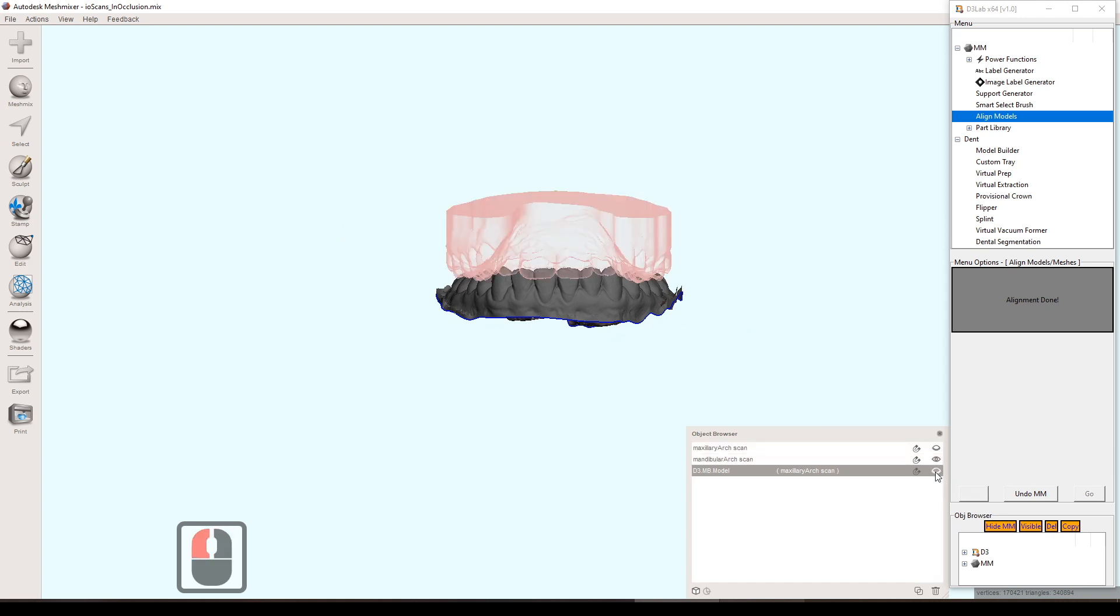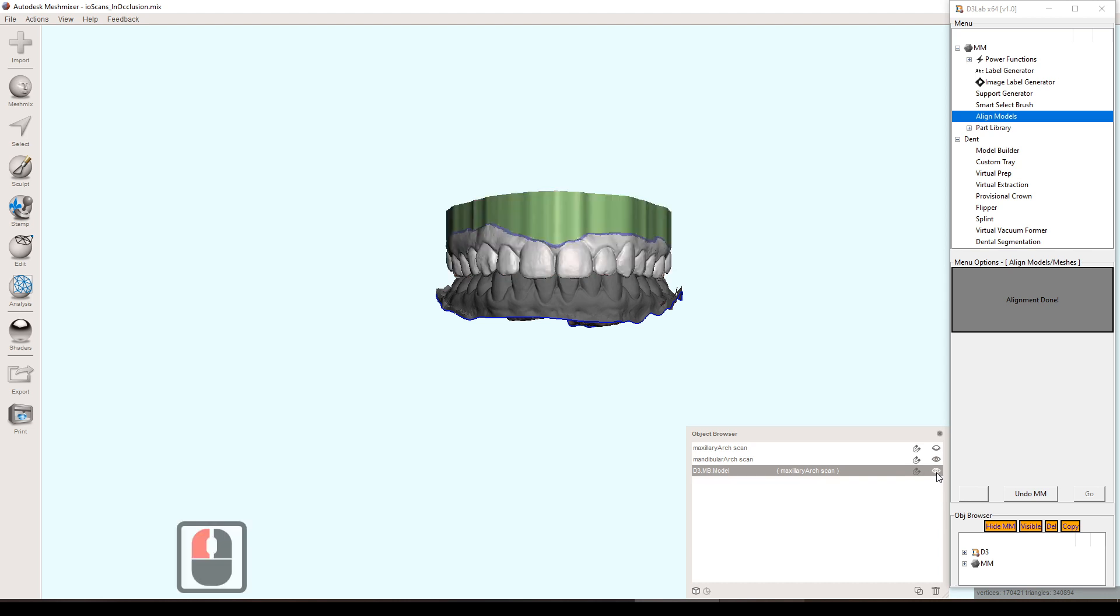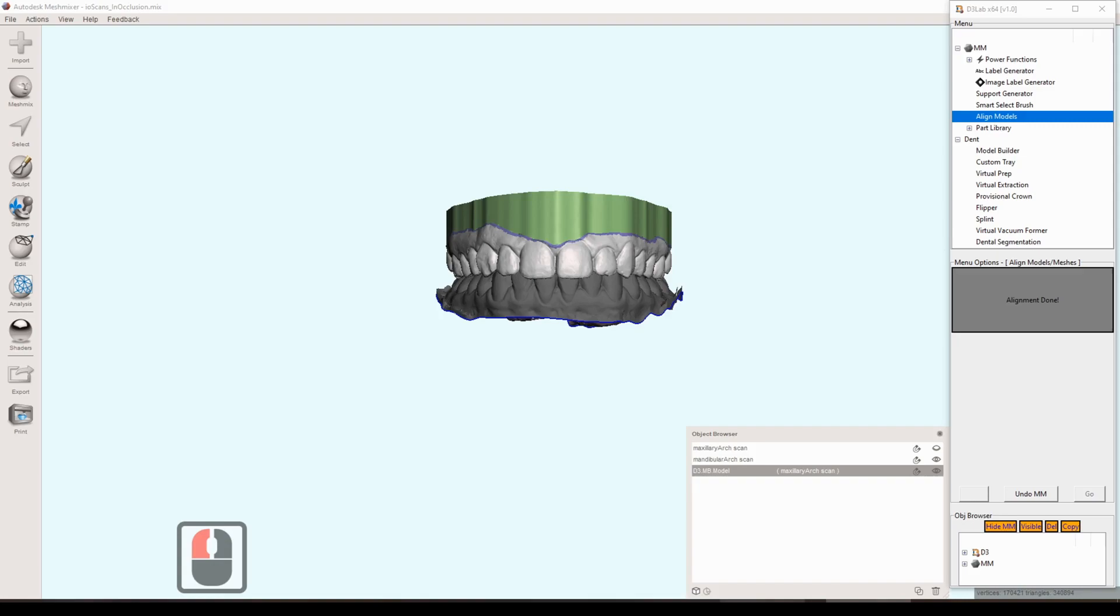You definitely do not have to do that if you're just going to be 3D printing these for doing aligners or things like that. But if you're going to be needing this in occlusion for other things down the road, this is good.